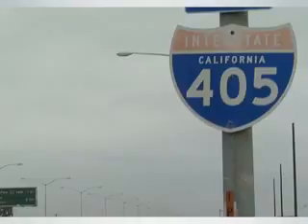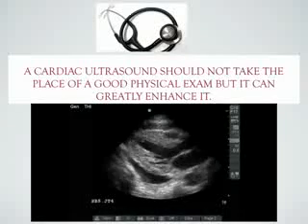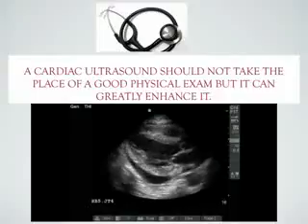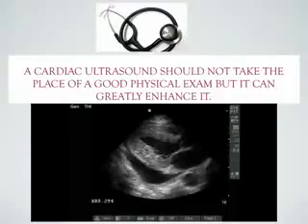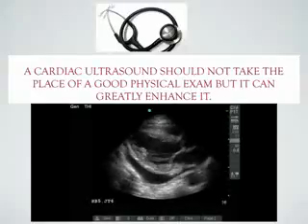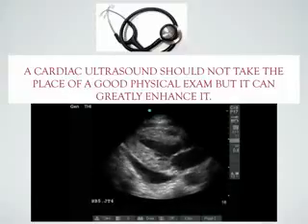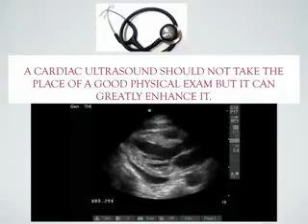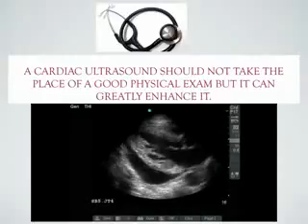So if you don't drive blind on the freeway, why would you ever examine patients blindfolded? And to me, that's kind of what it's like using a stethoscope. Now, don't get me wrong. A stethoscope is an important part of the physical exam, and a cardiac ultrasound should never take the place of a good physical exam. Physical exams are crucial, and that should never be misunderstood. But ultrasonography can oftentimes greatly enhance the physical exam.